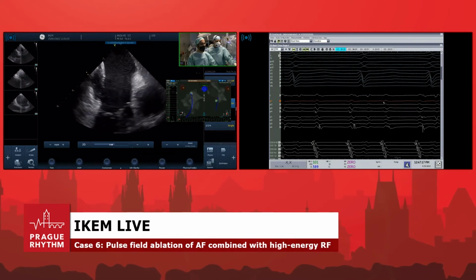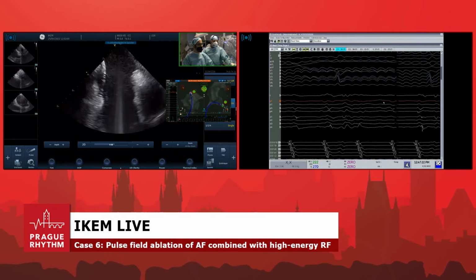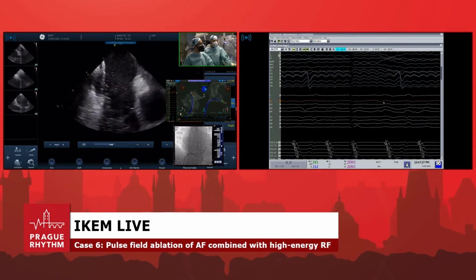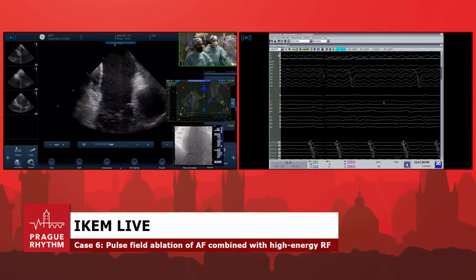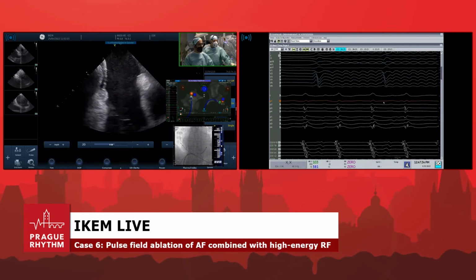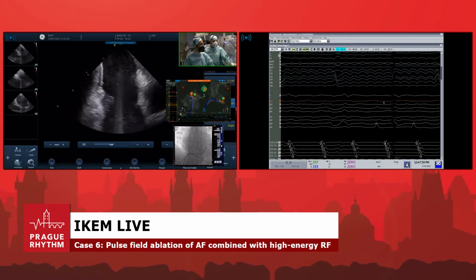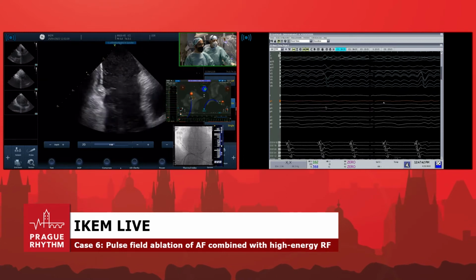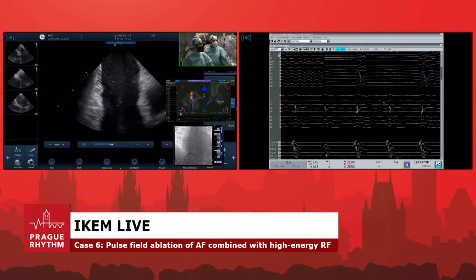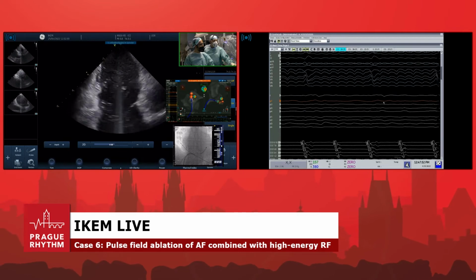Okay. So we're going to apply the first lesion. We are ready to pace. Okay. So wait a bit. And you can see the whitening on ICE. And I think the cycle length prolongs a little bit. Still the same? But it goes under 2 lesions and we're done. I'm pretty convinced and confident.